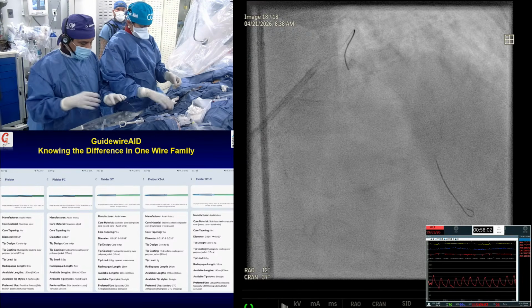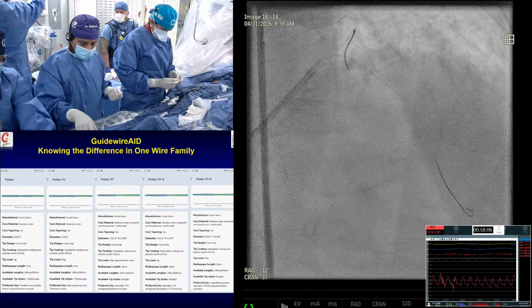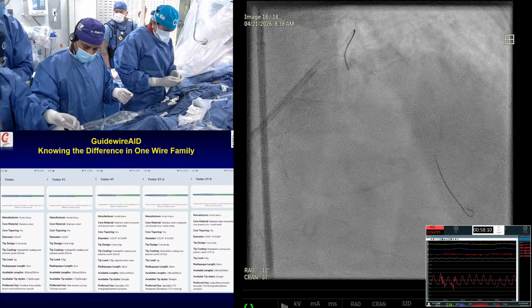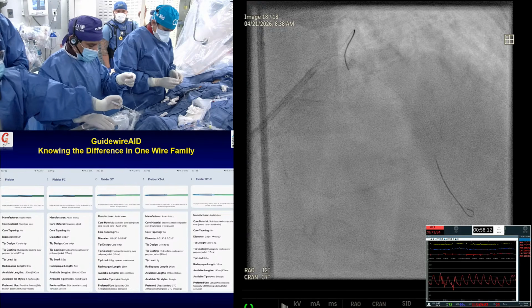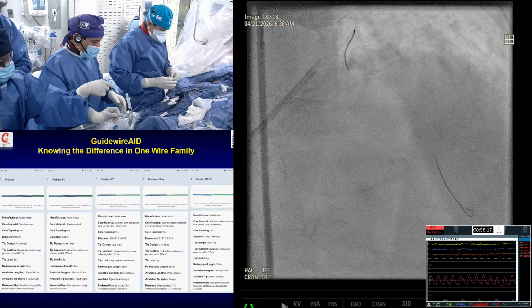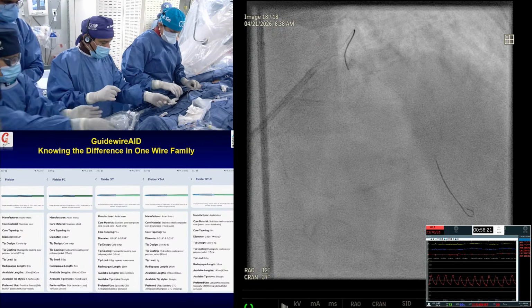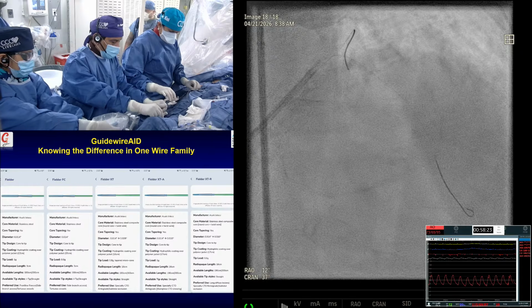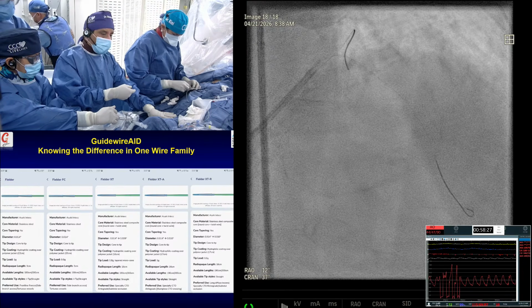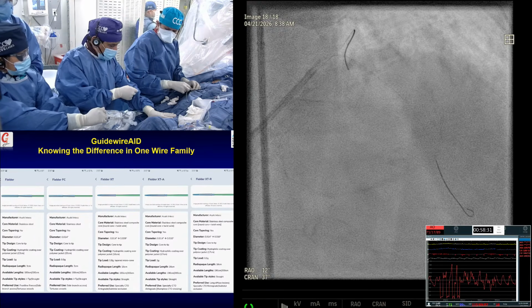I know it would be difficult, but would it be impossible to image over a rota wire? No, we can. I do it. Yeah, it can be done, but not easy. And not recommended, I think. Because if anything happens and it lifts the plaque, then putting additional devices will be a little difficult. Now, you can do it on the Wiper wire, which is still okay. No, rota wire we have done multiple times.